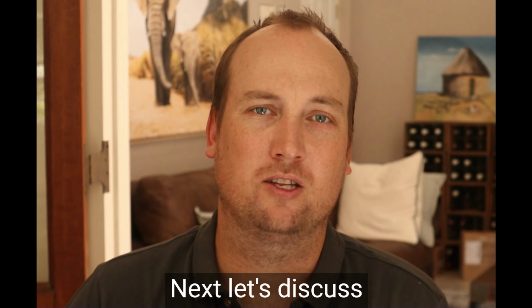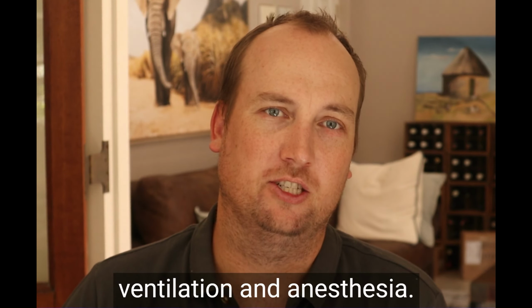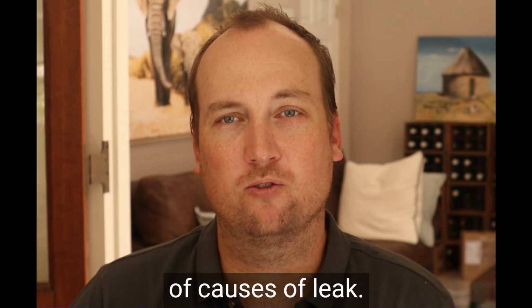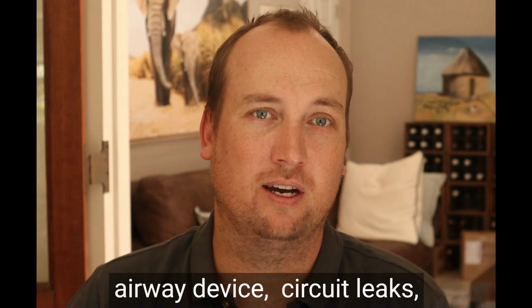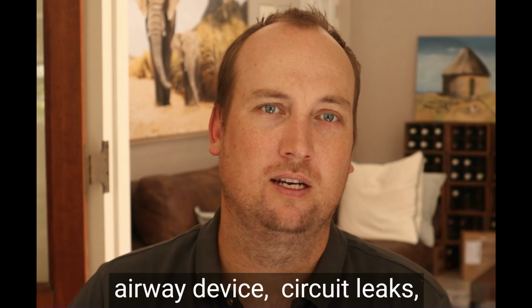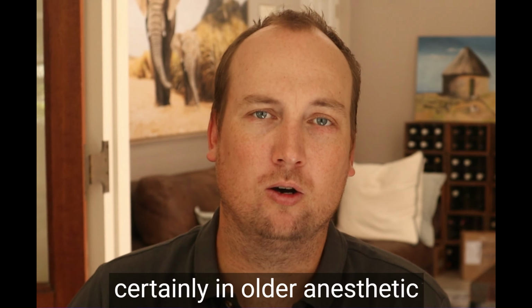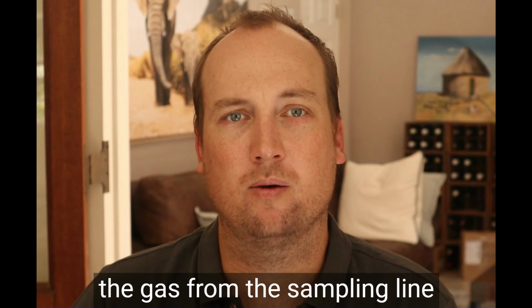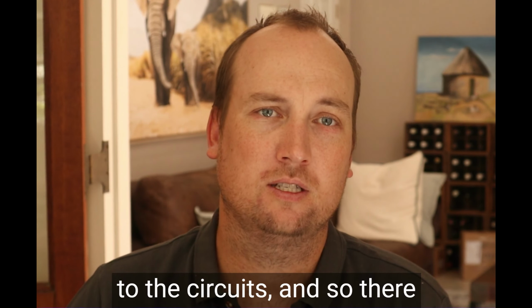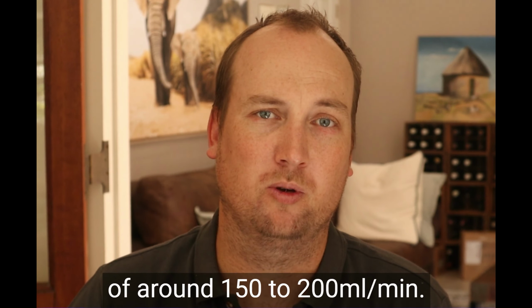Next, let's discuss the problem of an airway leak during anesthesia. Leaking of anesthetic gases is common during ventilation and anesthesia, and there are a number of causes of leak. This may include a misplaced airway device, circuit leaks, leak from the gas sampling line or the gas analysis. Certainly in older anesthetic workstations, they didn't return the gas from the sampling line to the circuits, and so there was always a minimum leak of around 150 to 200 mLs per minute.